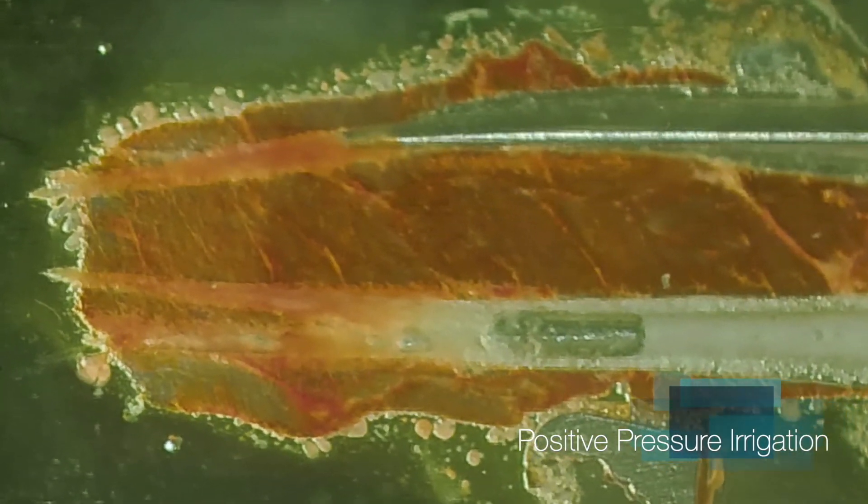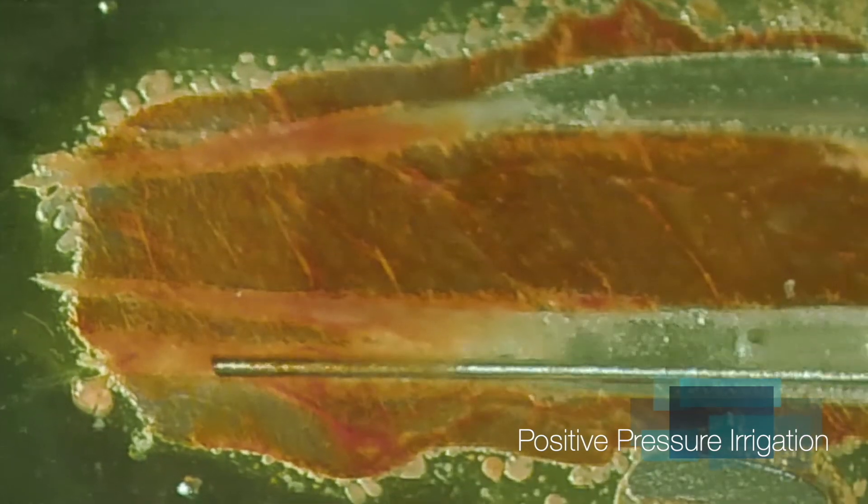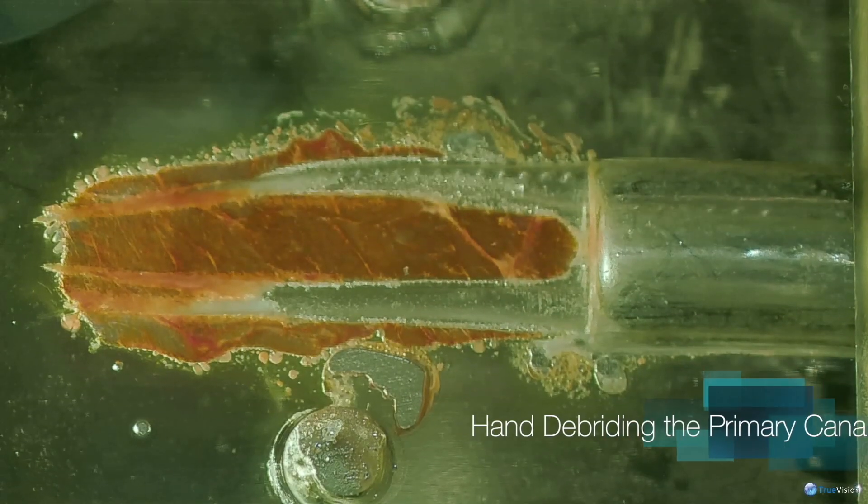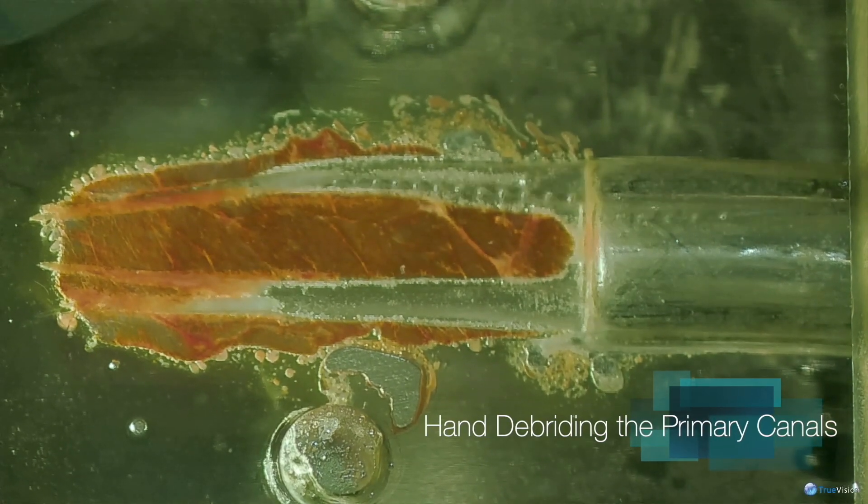Look at what's left after hand instrumentation. Here's positive pressure irrigation that won't be able to affect the apical zone until more preparation is accomplished.